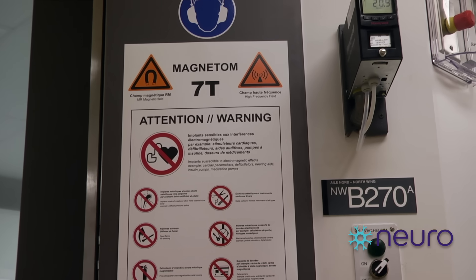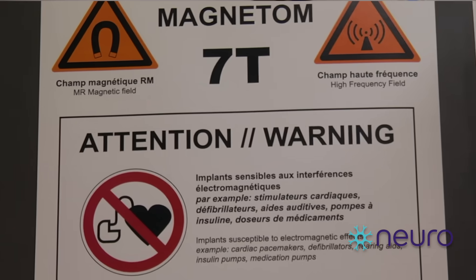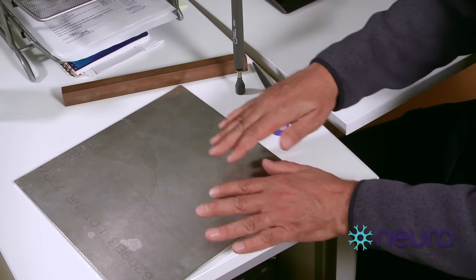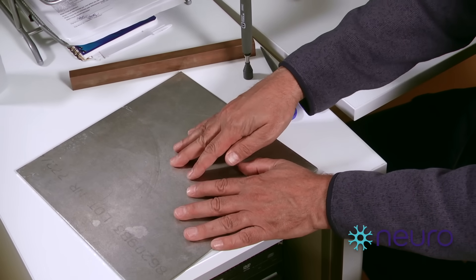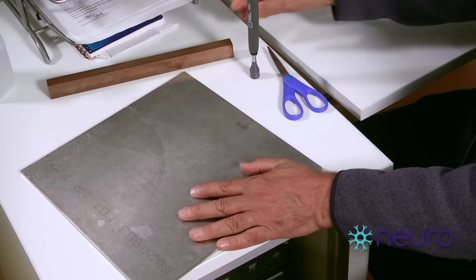That's an important safety issue with MR. We do a lot of training in order to make sure that people are sensitized to the need to keep metal objects away from the system. Now, it's interesting to see how these non-ferromagnetic metals behave when brought in proximity to the MRI system.